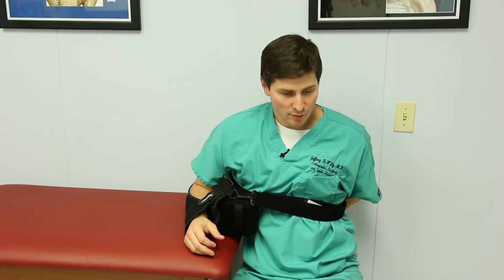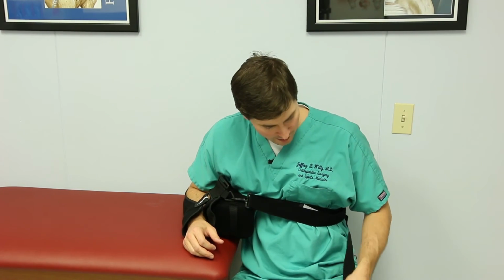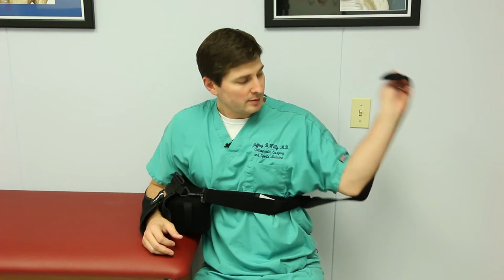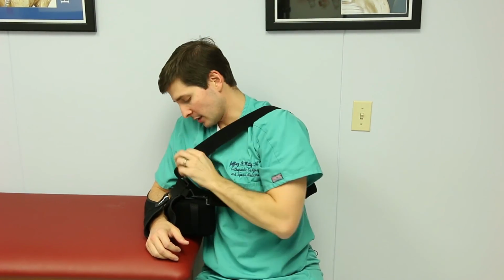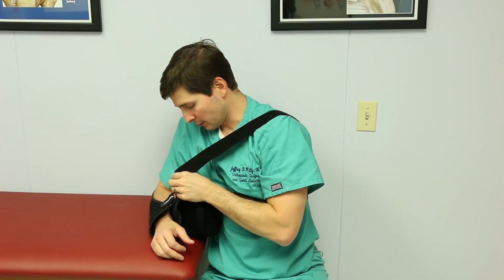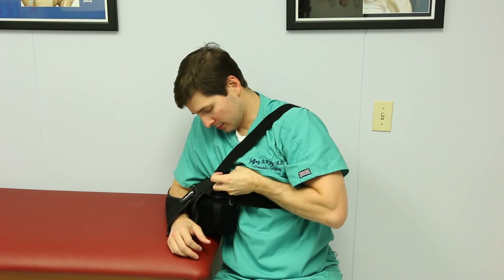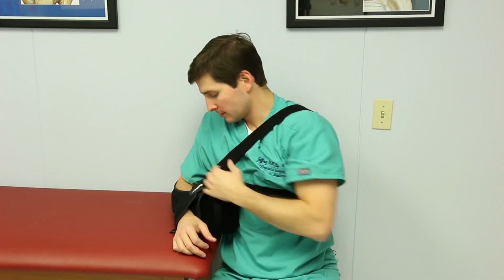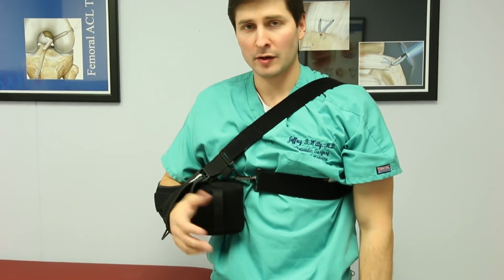Then finally, there's one more strap to this particular shoulder sling. That's it right here. Now I can take this, flip it over my shoulder, just like that. Thread it through with one hand, and then pull it on up, and then you're all set. You can stand up, and there you are, you're ready to go.